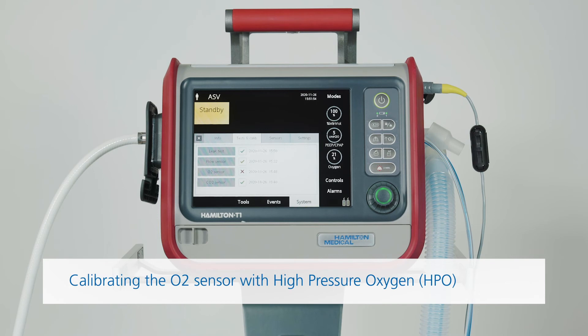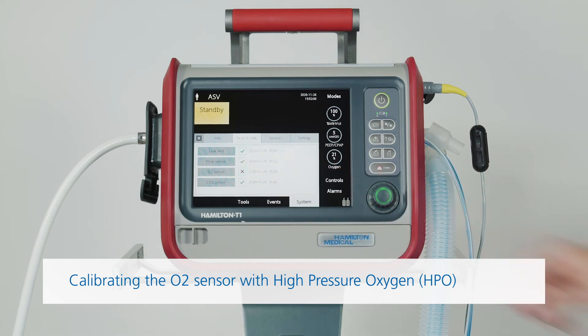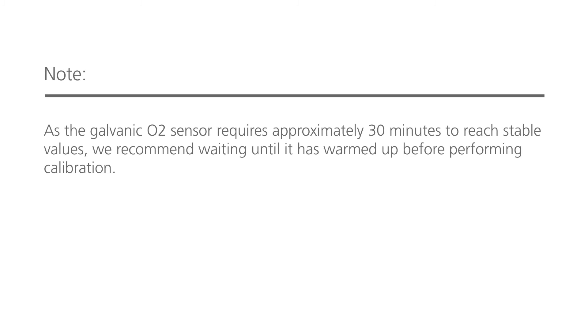You only need to calibrate the oxygen sensor if a red X is displayed in the O2 sensor checkbox or if there is a related alarm. You can calibrate the sensor either when the ventilator is in standby or during active ventilation. Calibration takes around 2 minutes.